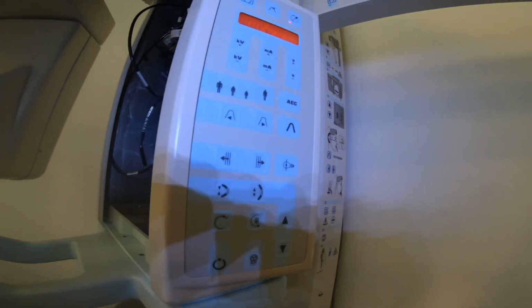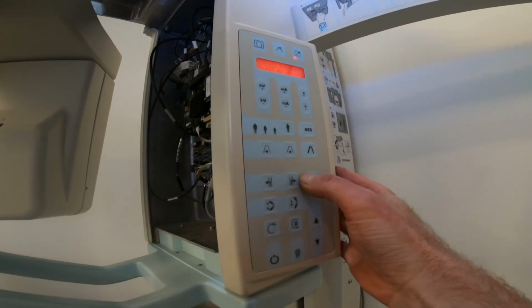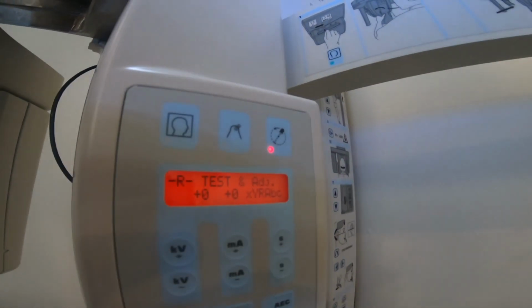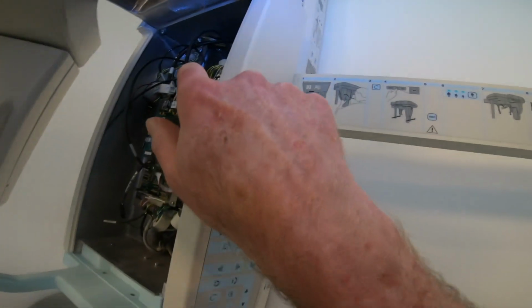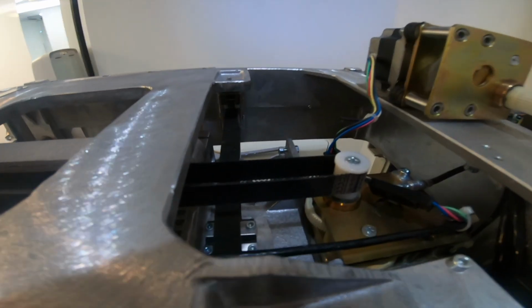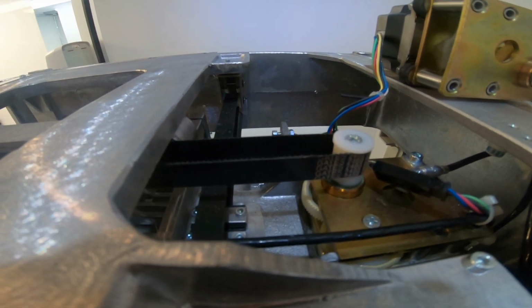So now we're testing the pins, the middle 4 pins. And right now the wire is hooked up to the belt there, and you can see it's moving. And it works. So that worked.